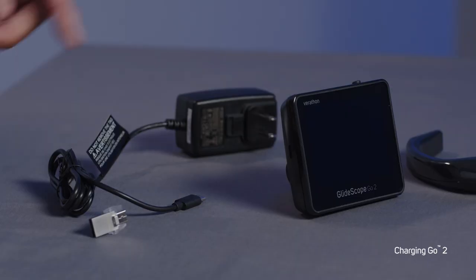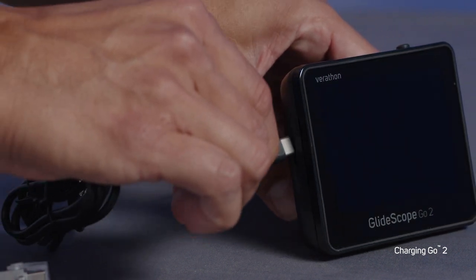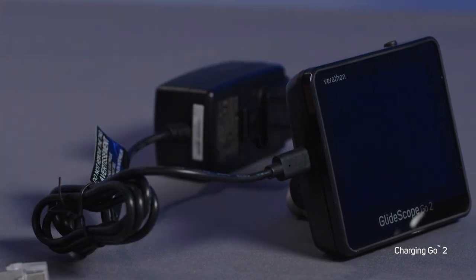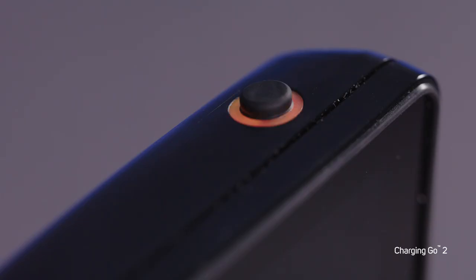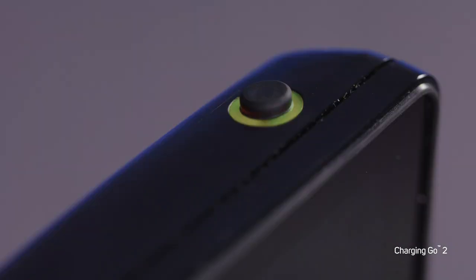Varathon recommends that you charge the monitor prior to first use. The GlideScope Go 2 includes a rechargeable internal lithium-ion battery. Included in your Go 2 monitor kit is a USB-C and power adapter. The power adapter has a USB-C connector that you plug into the USB-C port to charge the monitor. Once you plug in the Go 2 monitor to charge, the LED ring should illuminate. When the LED ring is solid orange, the battery is charging with an approved power adapter. When it is solid green, the battery is fully charged.